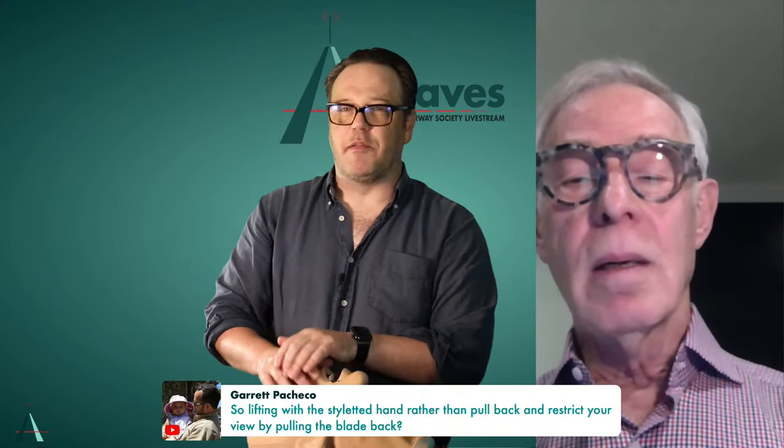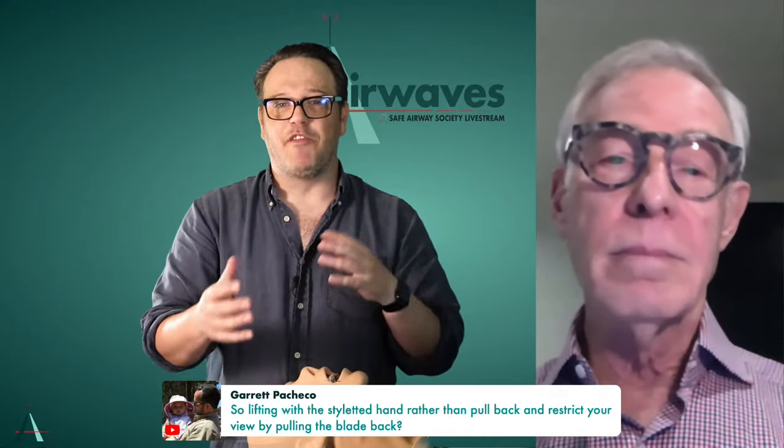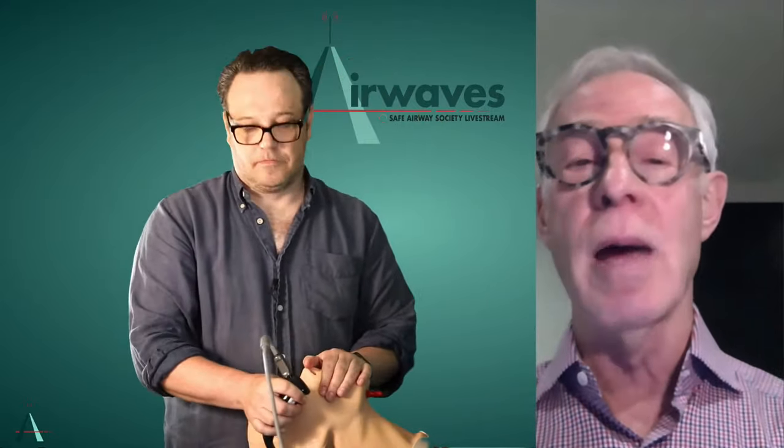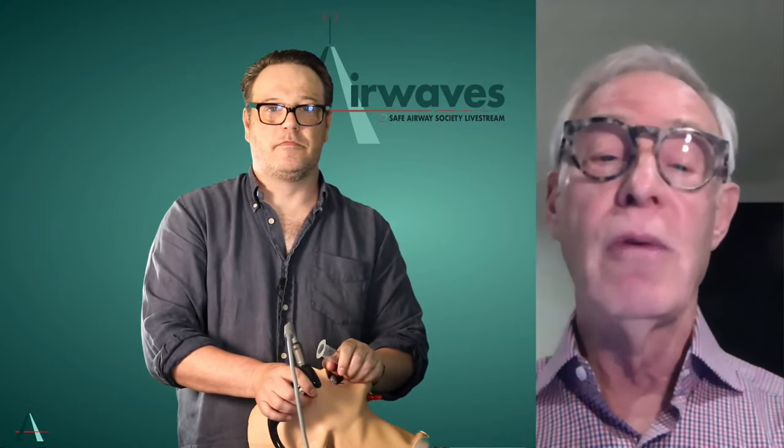So I think this is a question about, people talk about getting a deliberately poor view of the larynx, and that's not something you've mentioned, that you might end up with a poor view, but you've not mentioned that as a goal. Is that right? Or a compromised view? I think, as I said before, that most of us are accustomed to deeply engaging the vallecula and maximizing laryngeal exposure. And that tends to make use of a hyperangulated blade more complicated than it needs to be. And actually, that may be a setup for failure. So my initial insertion is the laryngoscope blade at the base of the tongue with elevation, not angulation. And I generally don't have to pull back, but sometimes I do pull back.